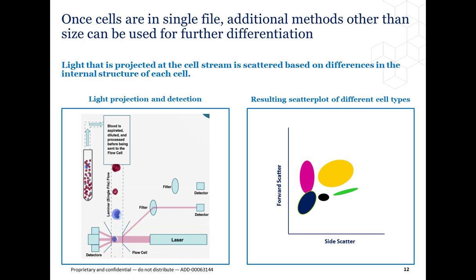The dots are plotted at a point determined by the intersection of the channel information designated on the X and Y axis. For example, if a cell falls in channel 50 on the X-axis and channel 50 on the Y-axis, it is plotted at the intersecting point of the 2 channels. So the scatter information may be plotted in various combinations to yield different information about the sample. And you may have multiple scatter plots that you could review looking for abnormal events.